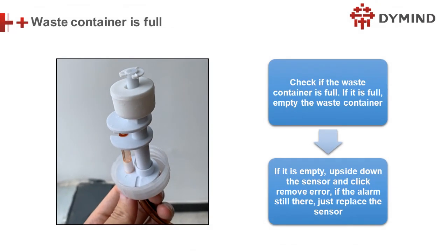Waste container is full. Generally, this problem is caused by the sensor, but the warranty of this sensor is only 1 year. So remember, it cannot be crushed. For example, if it falls on the floor, it will be broken. Why? Because inside is a magnet. If the magnet is out of order, this sensor has to be replaced. So how to check it? We can check it manually, check the connection and check the function of this floater.